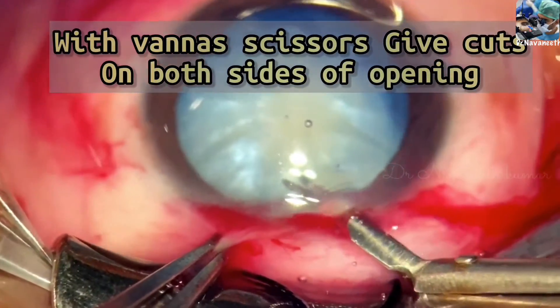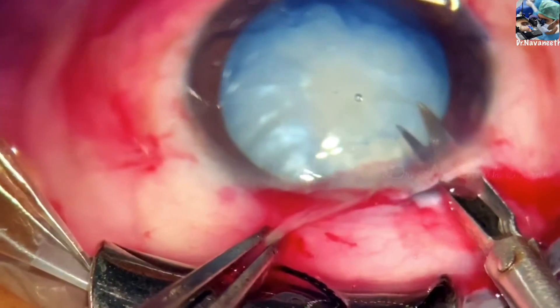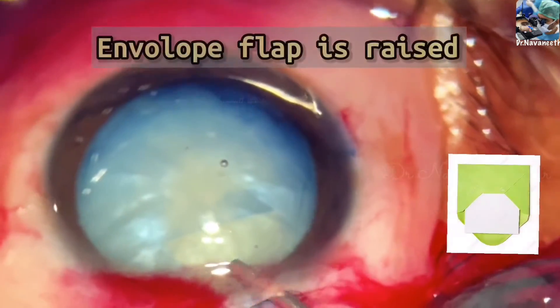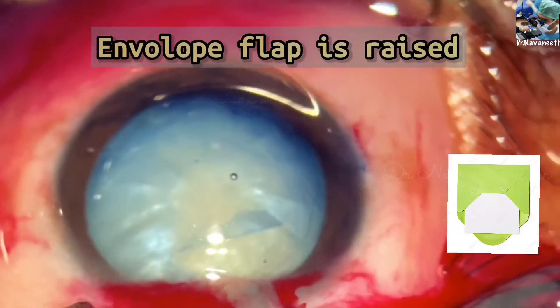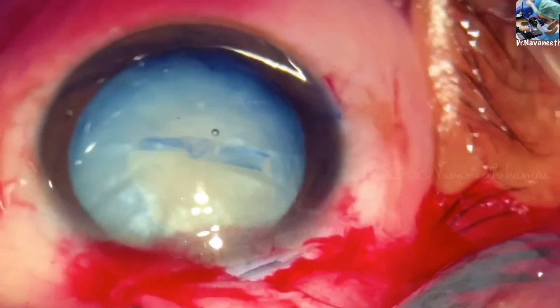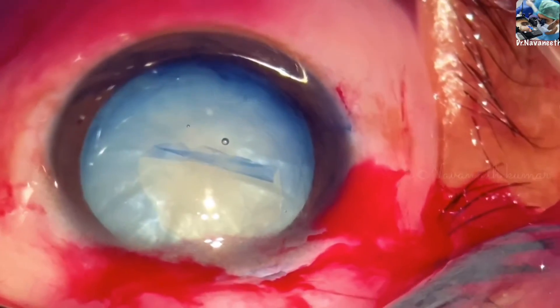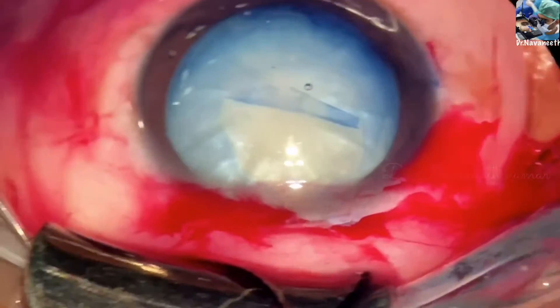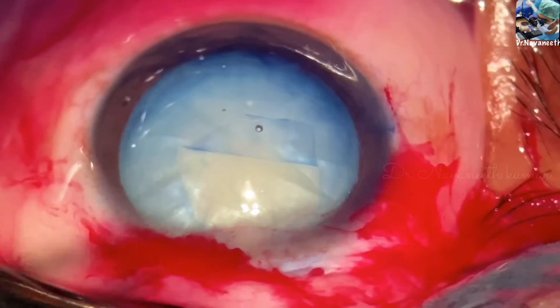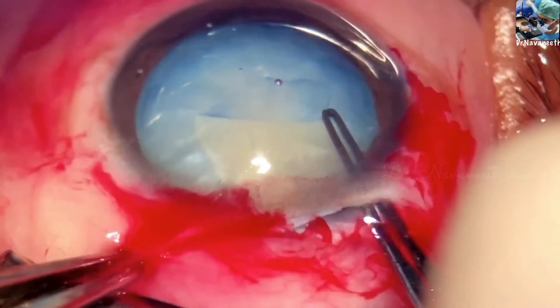The keratome entry is expanded with Vannas scissors by tangential cuts on both sides, followed by capsulotomy extension with capsular forceps. This flap creates an envelope-like cover, which is why it is named envelope capsulotomy.